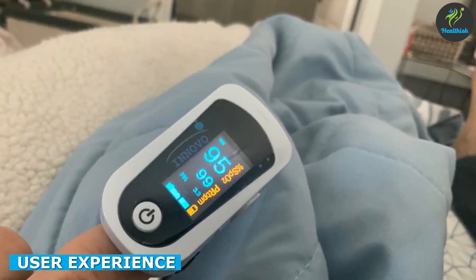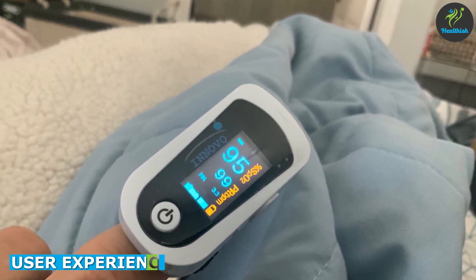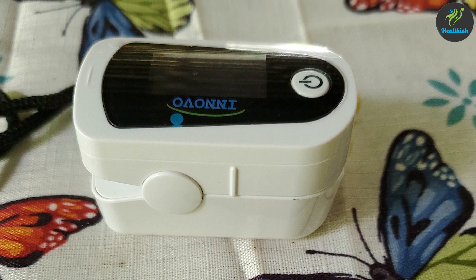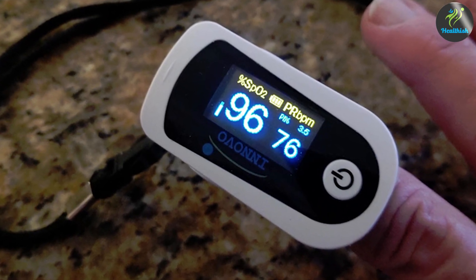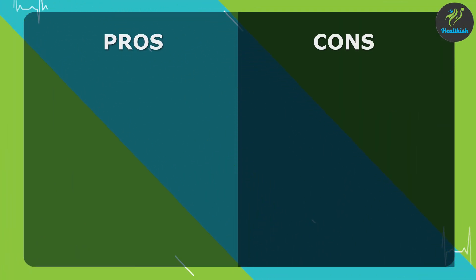Now, let's discuss the user experience of the oximeter. Users appreciate the device's simplicity and ease of use. The fingertip design makes it comfortable to wear, and the one-button operation allows for quick and hassle-free measurements. The LED display is clear and easily readable even in low-light conditions. Furthermore, the device is lightweight and portable, making it convenient for travel or on-the-go use.